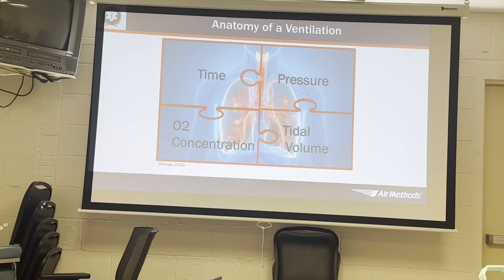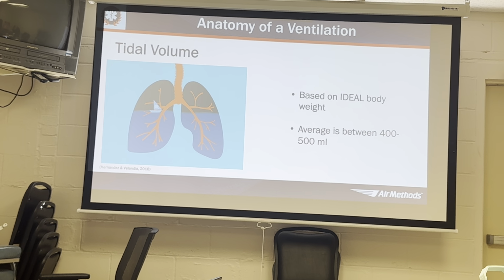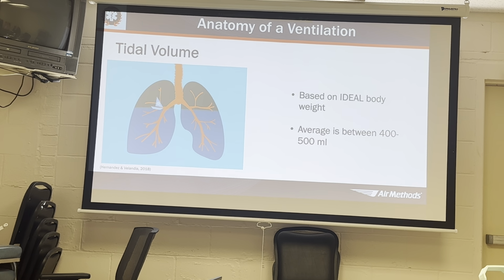And then time is a big factor in all of this, right? So we can only give so many breaths per minute. So that's our respiratory rate, but it also affects a lot of things that we'll get into in a little bit. Time is actually the worst factor in all of this, something that really plays against us. So tidal volume is based off of somebody's ideal body weight.